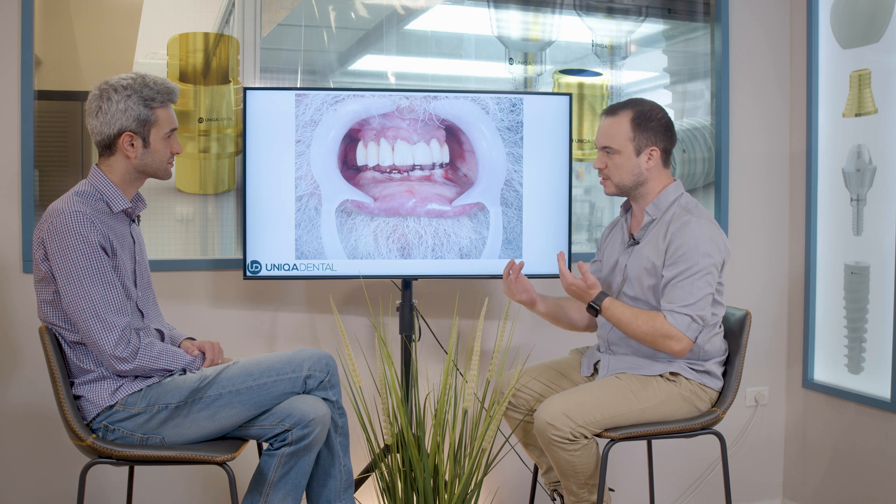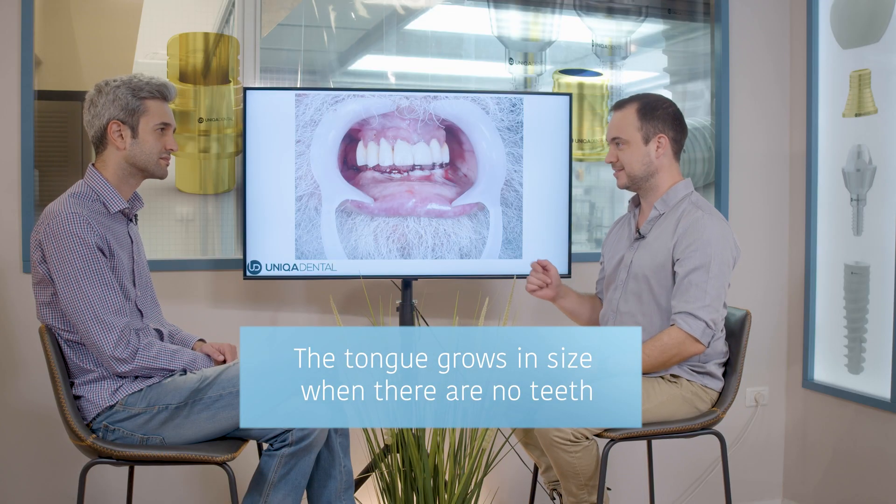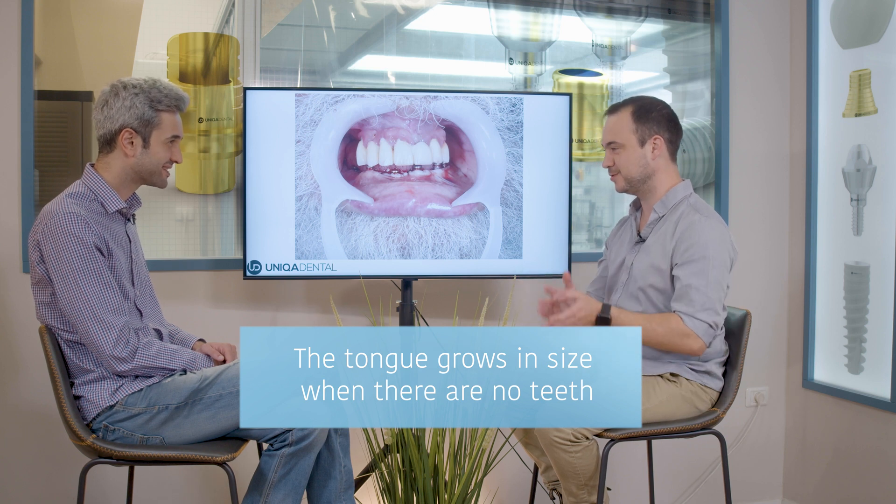Every time, if you want to move from one abutment to another, the gingiva will move a little bit and the end result won't be as precise as it's supposed to be. These problems mostly occur on the lower jaw, because in the lower jaw you have the tongue — and you can see this patient has a very large tongue. He didn't have his lower teeth for quite some time, and when you don't have teeth, the tongue gets larger.